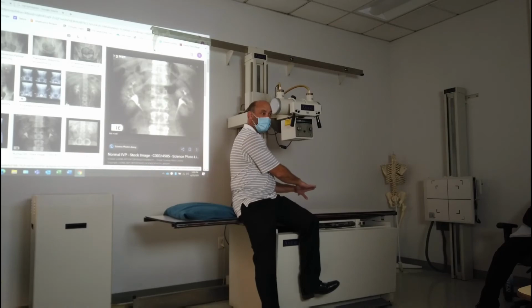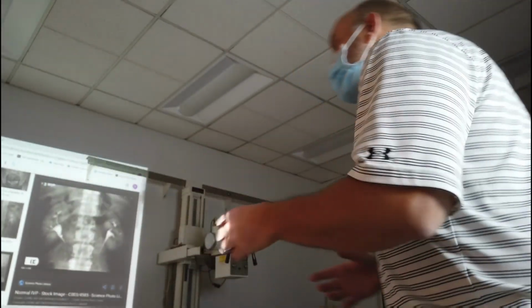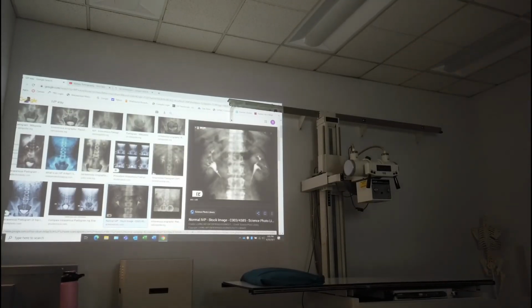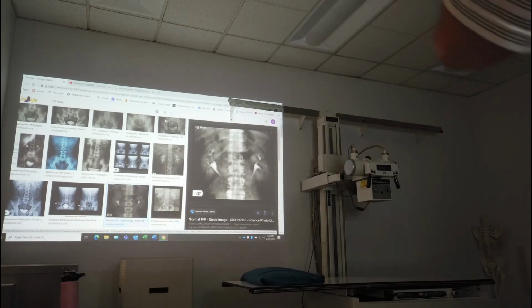But the area of interest, again called the fulcrum, is always nice and clear. It's crystal clear. So again, it uses the theory of motion to basically take all of that, the structures, and blur them out. You have to measure the patient to get the picture. Yeah, you have to take the calipers, you have to measure the patients.